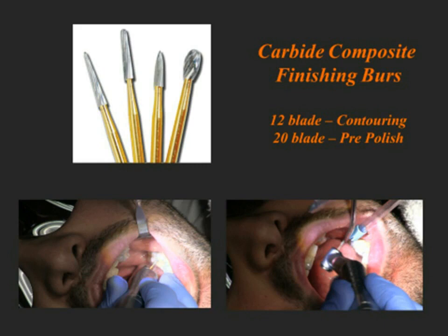Once the restorative material has been placed, now we will start the contouring and pre-polishing of the restoration. Even though these are small, remember pits and fissures are very sharp and tortuous. Most of the time you get pretty tight occlusion from the opposing dentition, and you'll need to check with articulating paper and do some minor adjustment. That's why the contour and pre-polishing burrs from the Comfort Cavity Prep Kit are very thin, narrow, pointed burrs which can gain access to these fissures and not polish or take away healthy tooth in the meantime.